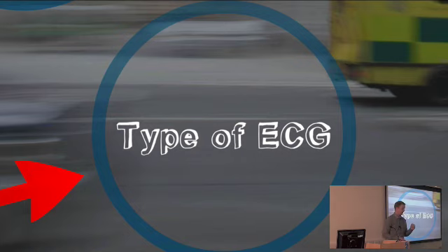And those extra 3 leads are chest leads, just like these 1 to 6. You've probably only got 6 wires for the chest leads, so you're going to take V4 to 6 off. You're going to put extra sticky labels on them. So just like V5 and 6 are in the same horizontal line, you're going to carry on in that horizontal line, but going around the back. And V5 and 6 are on two landmarks, aren't they? They're in the anterior axillary line and the mid-axillary line. Well, the posterior leads are the same. You need to put them on landmarks.